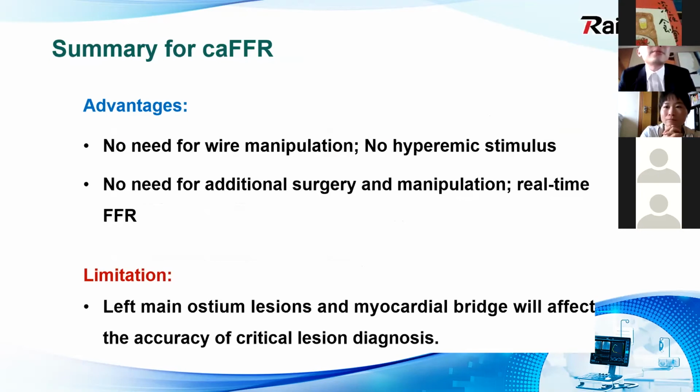So here comes the summary for caFFR. The advantages of it are no need for wire manipulation, no hyperemic stimulus, no need for additional surgery and manipulation, and we can get real-time FFR. Also, it has some limitations, because left main ostium lesions and myocardial bridge will affect the accuracy of critical lesion diagnosis.